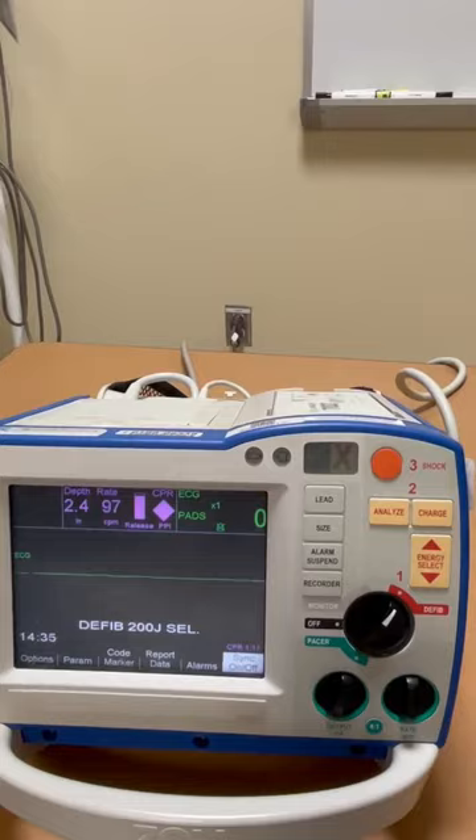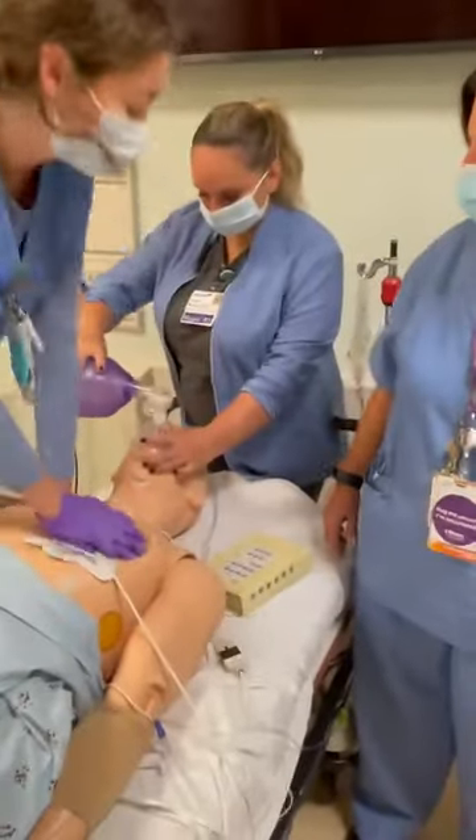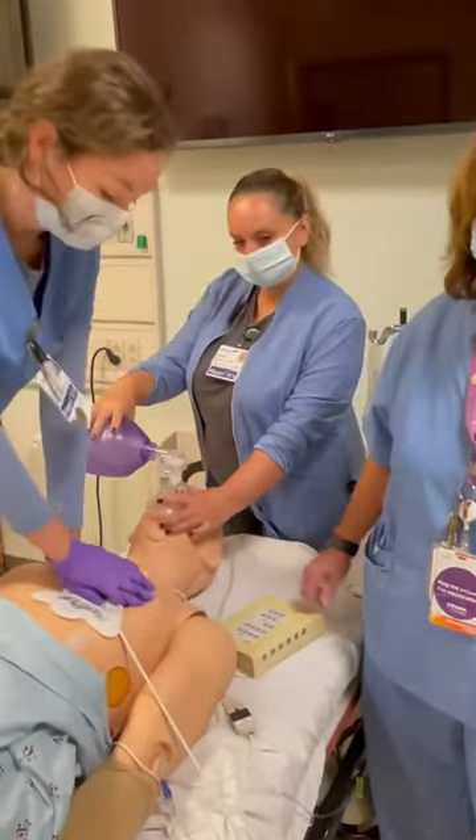At the end of 30 compressions, we want to give two breaths for every 30 compressions, and we should remember you want to squeeze your Ambu bag only halfway.